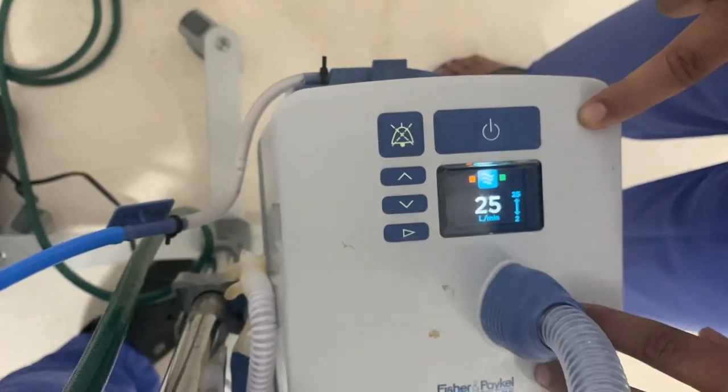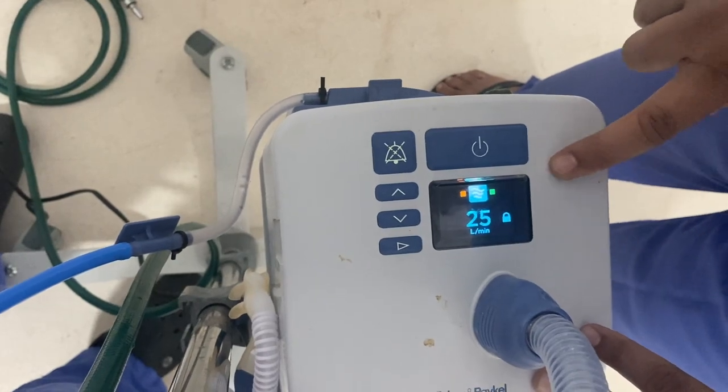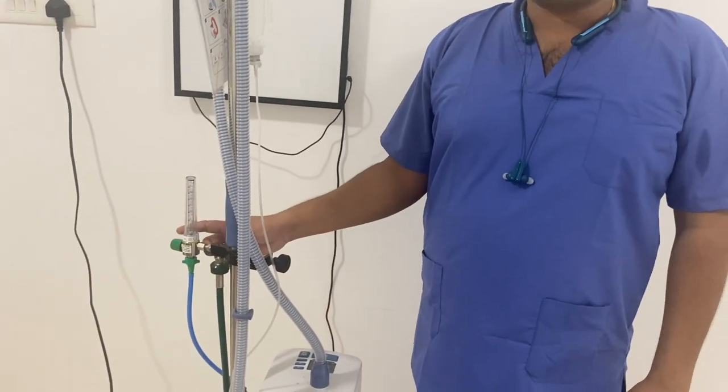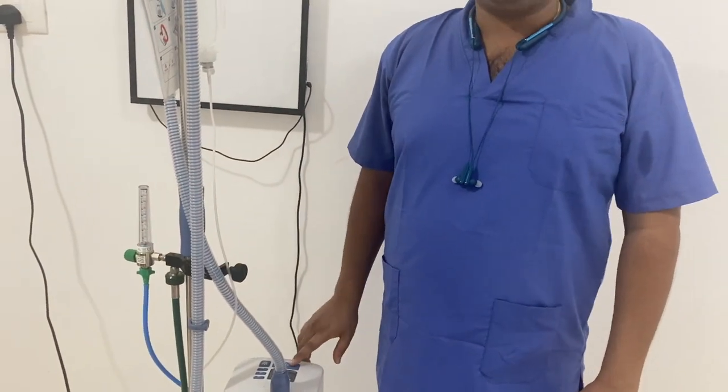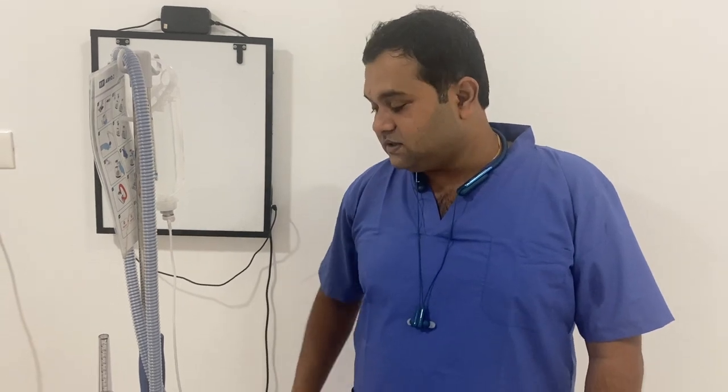When disconnecting the machine from the patient, we first switch off the oxygen and then switch off the machine. Do not leave the oxygen running when the machine is idle or not being used. So first the oxygen has to be stopped, then the machine has to be switched off.